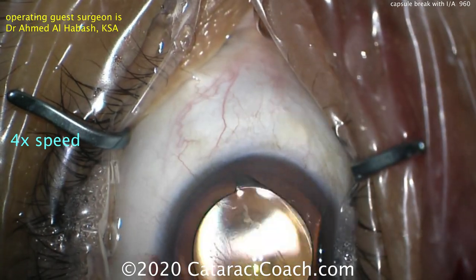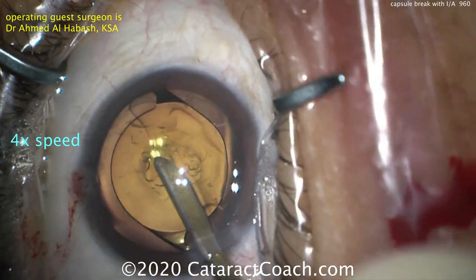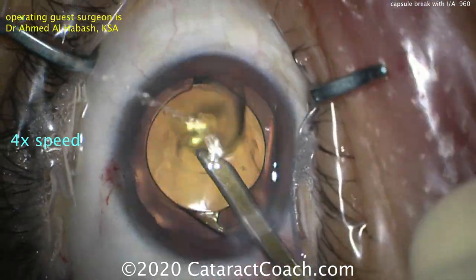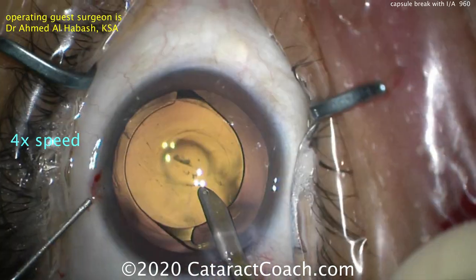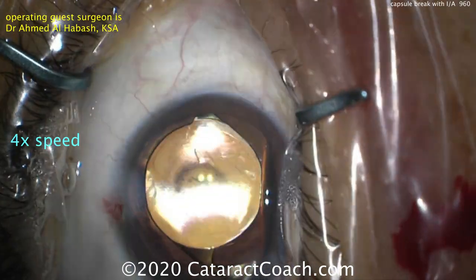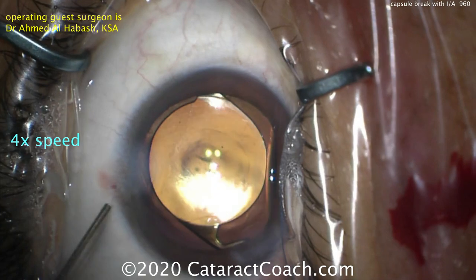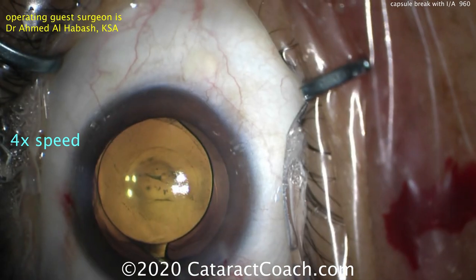At the end of the case, we remove the viscoelastic. In a situation like this, do not go behind the optic to remove viscoelastic. Using a Simco cannula to flush out the anterior chamber, be very cautious about going behind the posterior capsule — right now the optic is protecting it, covering and blocking any vitreous from coming forward. Notice no collapse of the AC — injecting balanced salt solution with one hand while pulling out the other instrument. Then plenty of hydration of the incisions, keeping the AC pressurized.